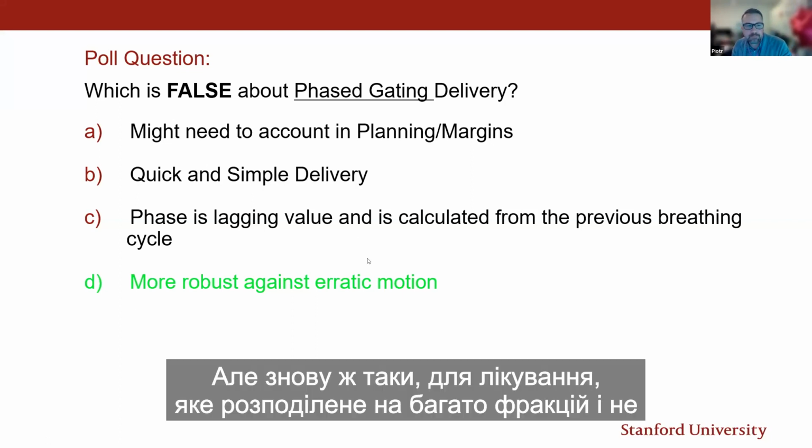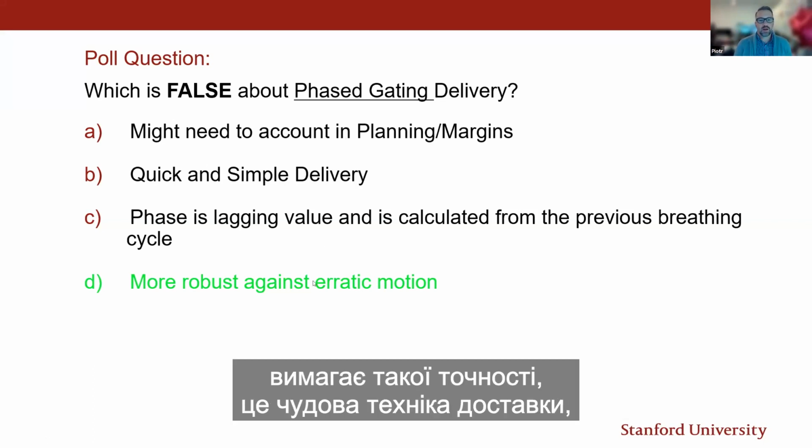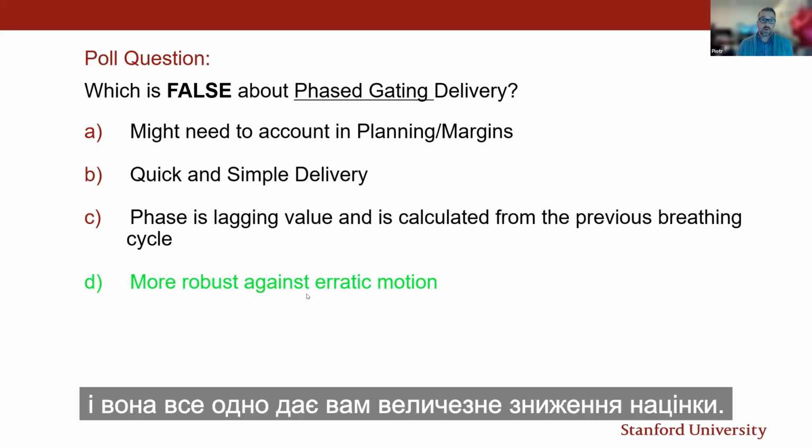But again, for treatments that are spread out over many fractions and don't require that amount of precision, it's a great delivery technique, and it still buys you a huge reduction in margins.